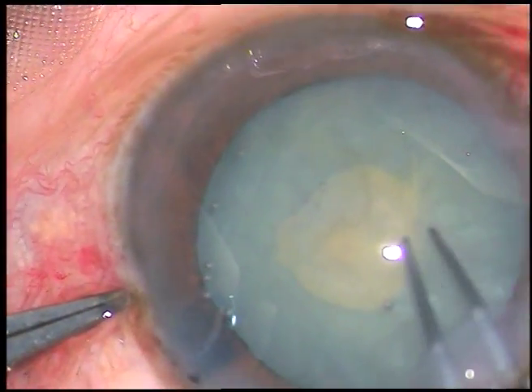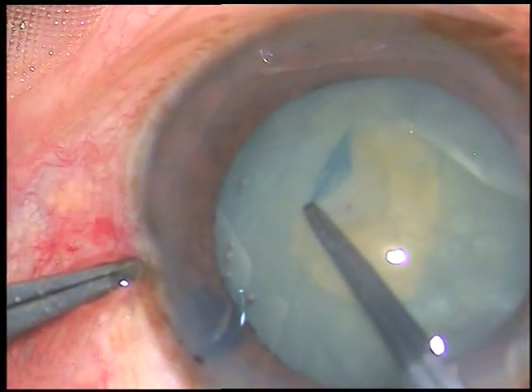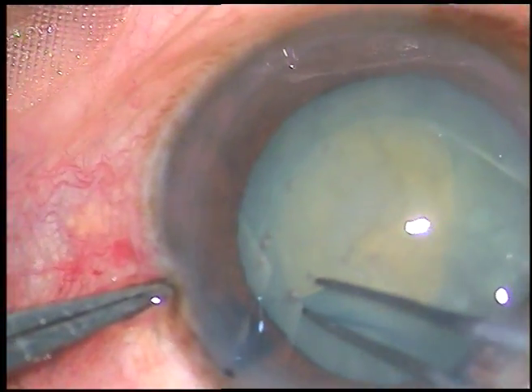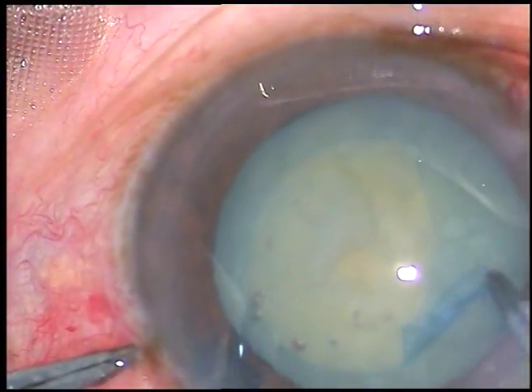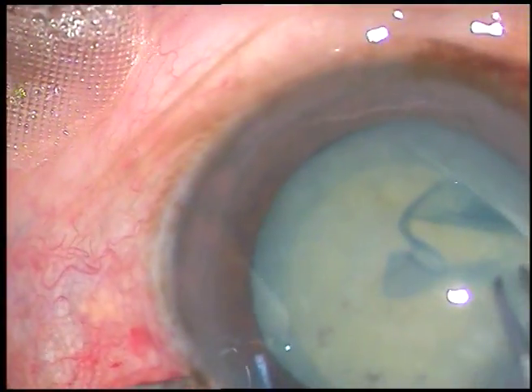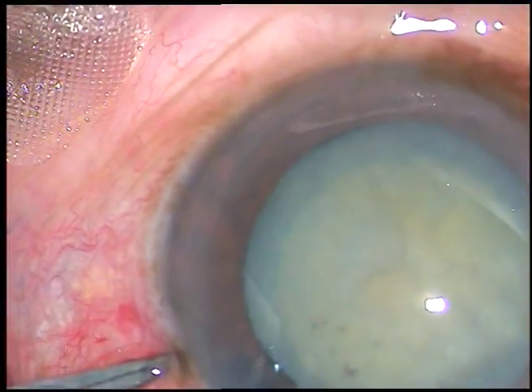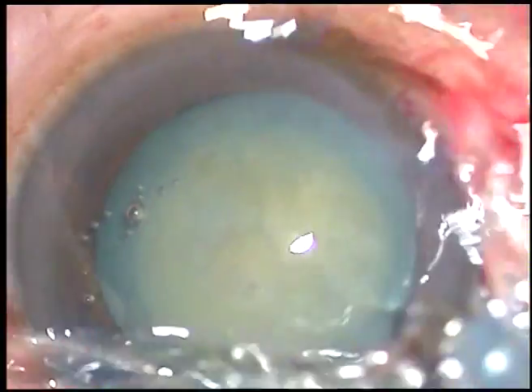I hold this capsular tag with Utata forceps, go anticlockwise and remain at a certain equal distance all around from the margin of the dilated pupil, and thus I make a fairly round rhexis in intumescent cataracts. I believe you also can do it.